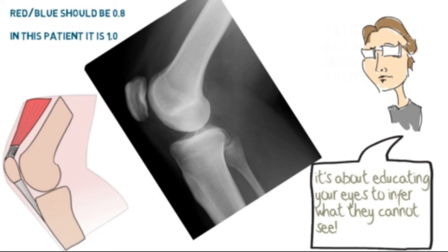At least from an X-ray you can get some information very quickly, and in many cases the information you get is better than from other imaging techniques.